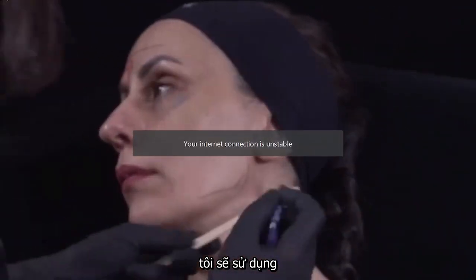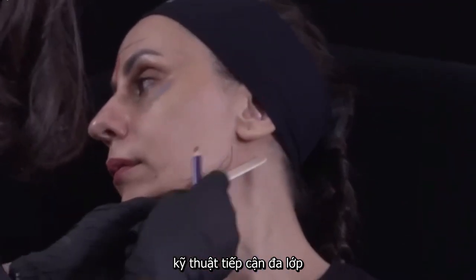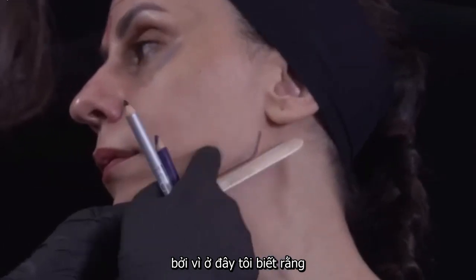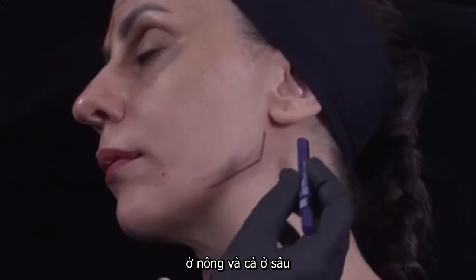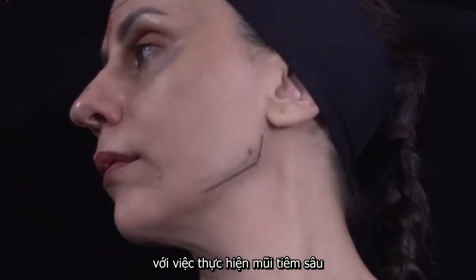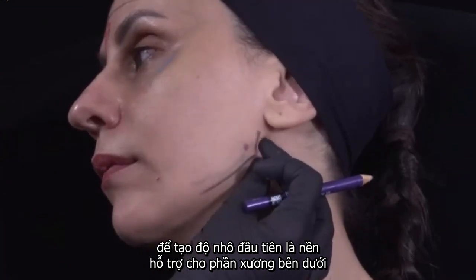I will be using the multi-layering technique because here, in the mandibular angle, I know I have no danger deep and no danger superficial. So I can work with the bolus technique with Teoxane Ultra Deep to first give a projection, a support of the bone.